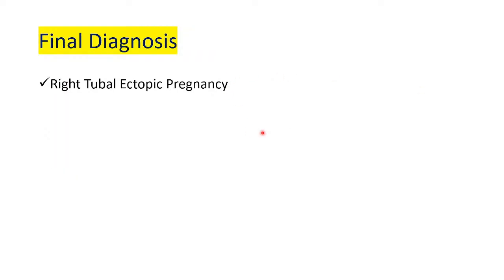So what's the final diagnosis in this case? What is it that is missed? It is a tubal ectopic pregnancy. Ladies and gentlemen, we should make an effort not to miss a tubal ectopic pregnancy. You must correlate your findings with the pregnancy test.